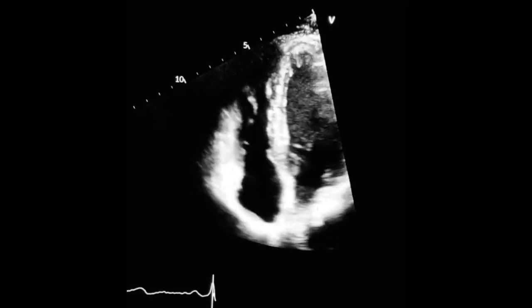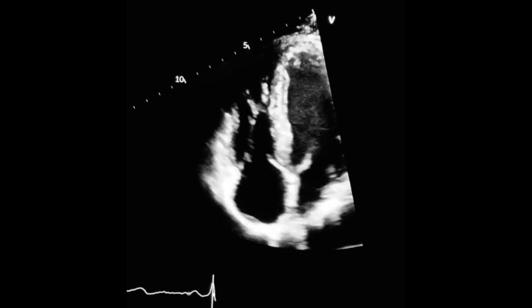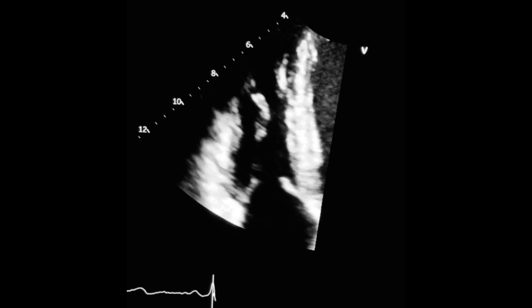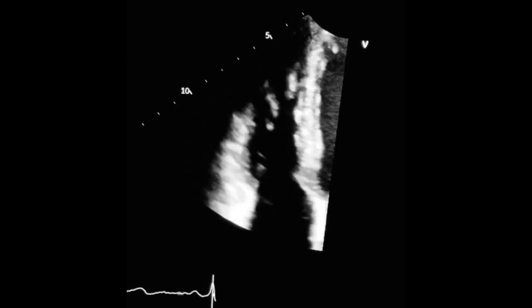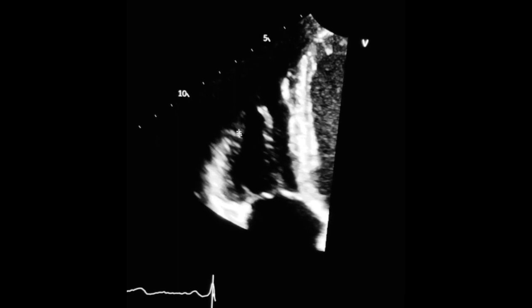To obtain the fractional area change, first find your apical four-chamber view. Now zoom in on the right ventricle. Freeze the image at end of diastole and trace the diastolic area of the right ventricle. Make sure you can fully visualize the right ventricle. Trace the endocardial border from the lateral annulus along the free wall to the apex and back to the septal annulus.